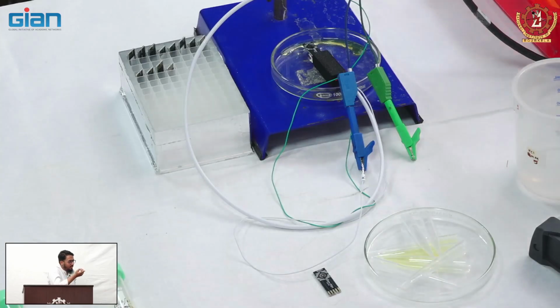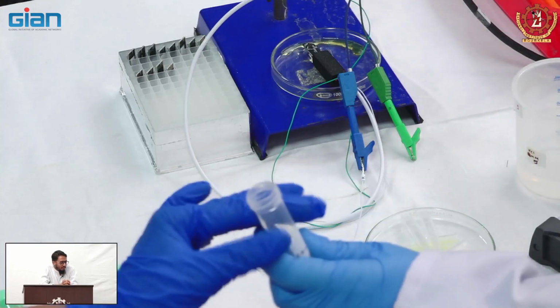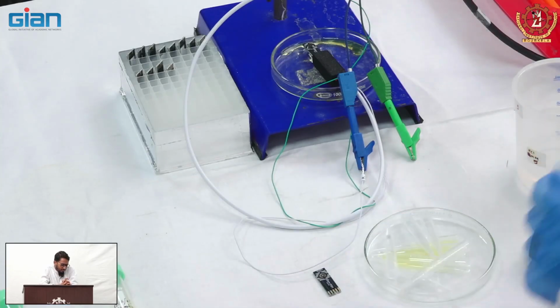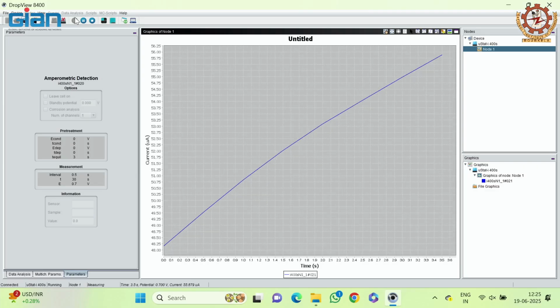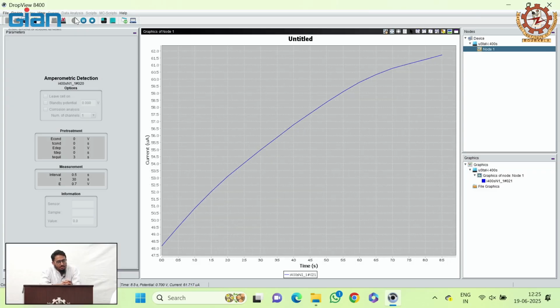This is 2.5 millimolars. Please make sure there are no air bubbles and that it's covering the entire surface. Switch to the screen. Started. 30 seconds run. Amperometry at 0.7 volts.